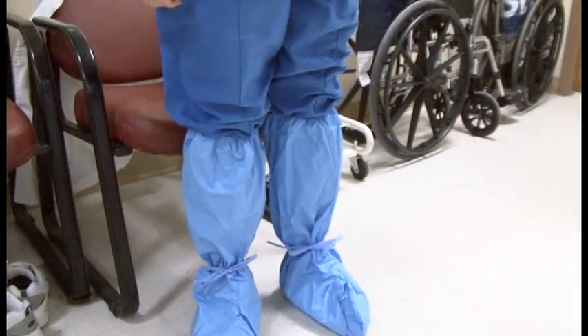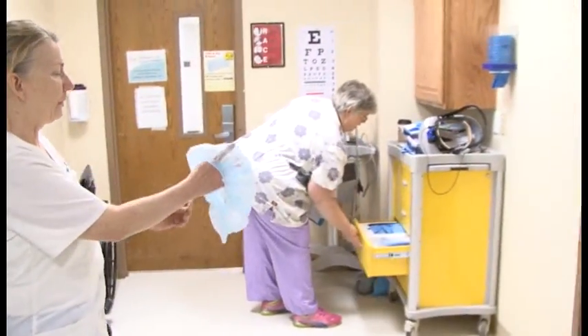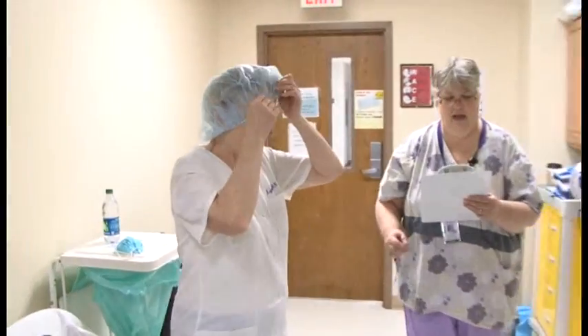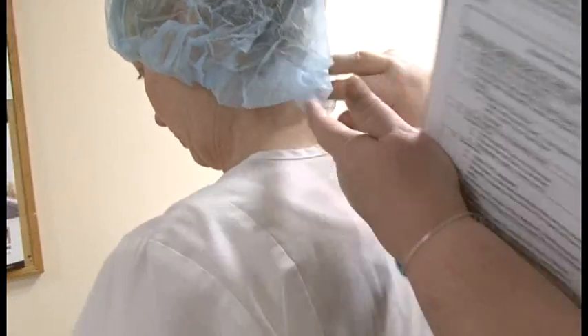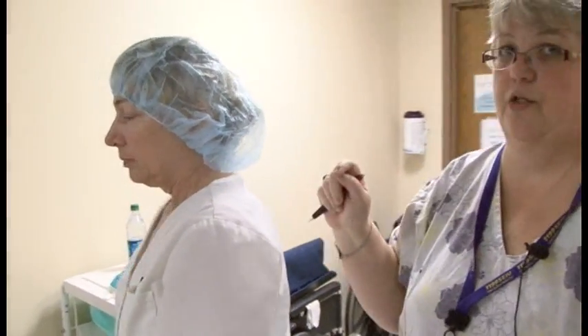The next thing Lynn is going to put on is her surgical cap. Start it low — as you put on other gear it tends to creep up — so place it right about the eyebrows, and your observer can check to make sure all the hair is contained. The cap is supposed to go over your ears.